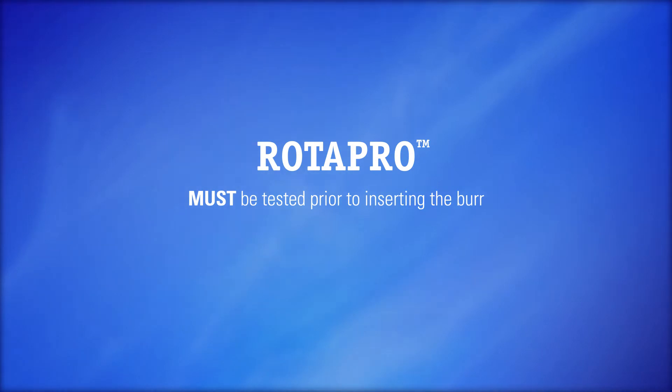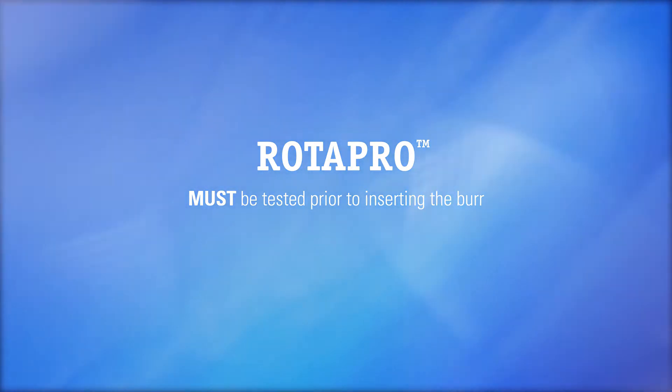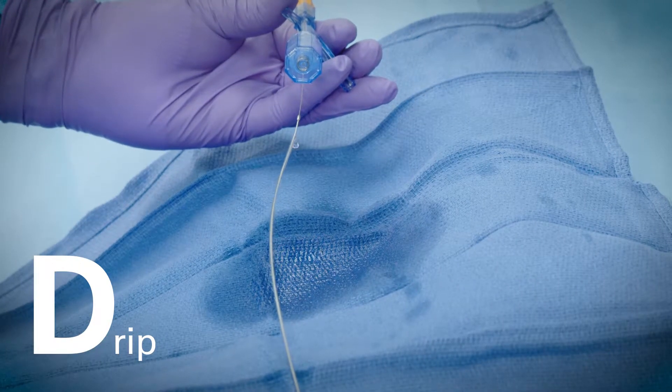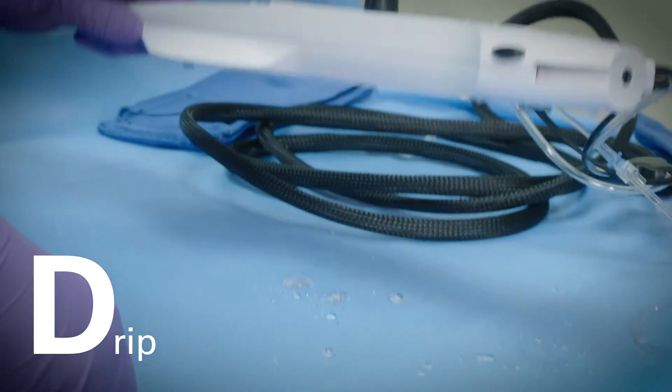The Rotopro rotational atherectomy system must be tested prior to inserting the burr into the guiding catheter or sheath. The acronym DRAW may be helpful in remembering the proper steps. D: Drip. Check that saline is flowing from the end of the burr catheter sheath and from underneath the advancer.